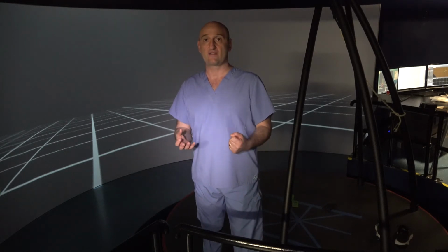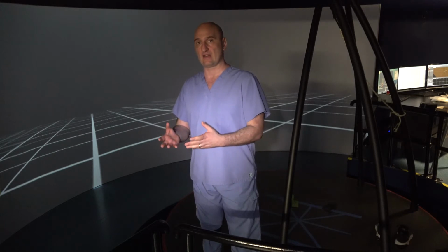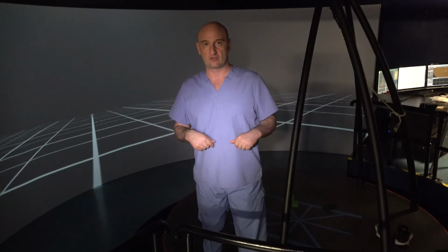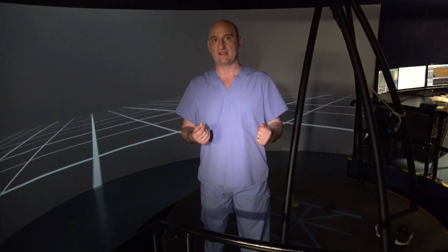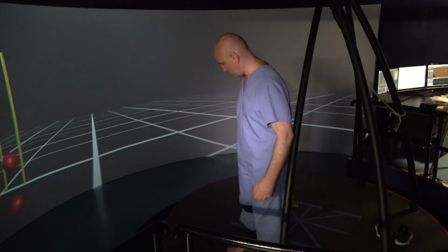Neuroscience is very sure that if you work in an environment and focus on a task where your attention is externally focused rather than internally focused on your body, which is typical of physical therapy, then the results are much faster because of enhanced neuroplasticity. So let me show you how this works.